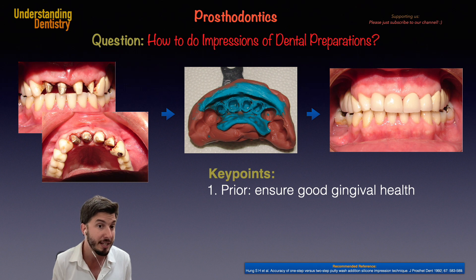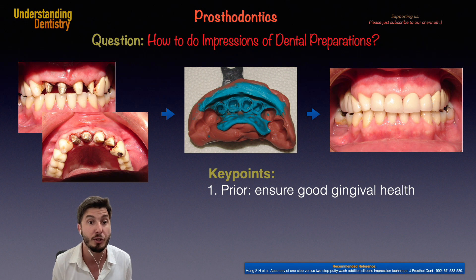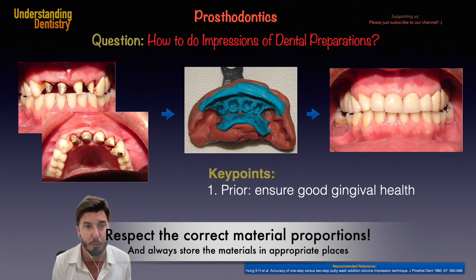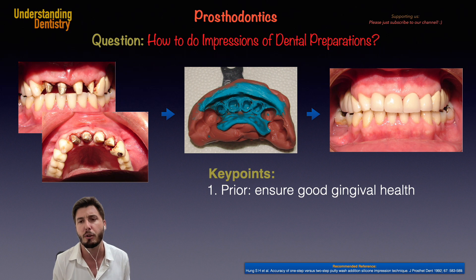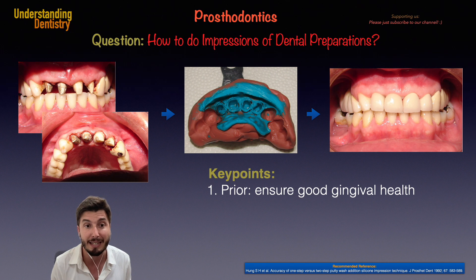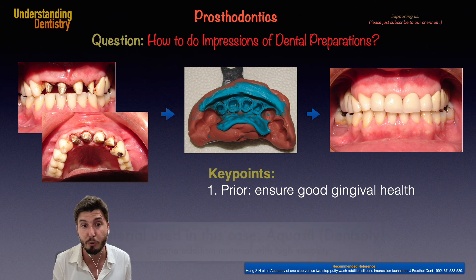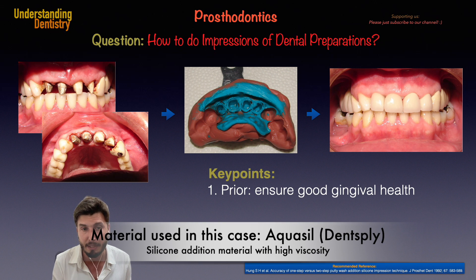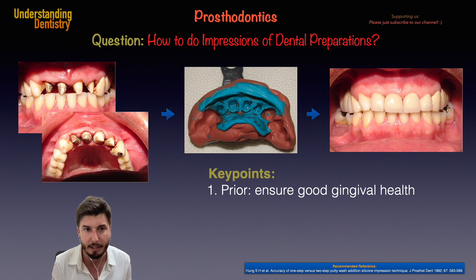In this case we are seeing four dental preparations, and probably you realize we are using addition silicon. You need to know how to use the correct material proportions and how to manipulate the materials. The method you are seeing on screen is the one-stage method — done at once. So hard and soft putty are mixed at the same time and used at the same time to perform the impression of those four preparations.